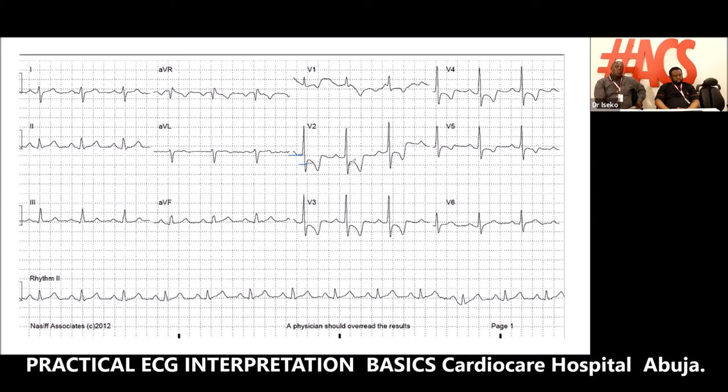So what do we call this? Linking it to what we discussed yesterday, we have ST segment depression from V1 to V4. If you have a corresponding presentation in this patient, chest pain and whatever, you can say this patient has a non-ST segment elevation MI involving V1 to V4. That means involving the anteroseptal leads. So this can go for an anteroseptal NSTEMI, especially if the patient presents with angina-like chest pain. Okay, but there's another thing we'll look at here, which I skipped teaching: right ventricular hypertrophy.